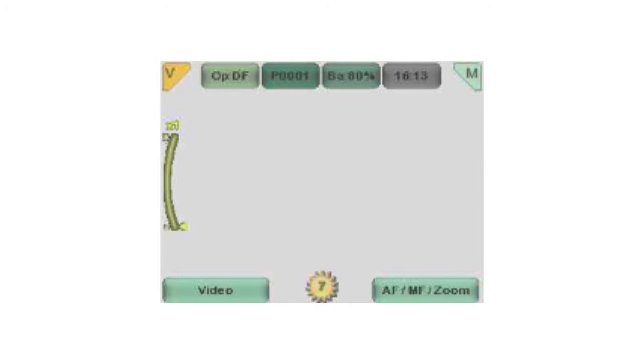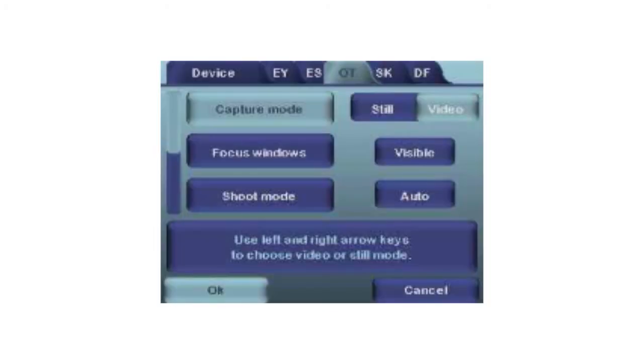The capture mode can also be changed in the OT menu. To activate the menu, press and hold the right soft key.